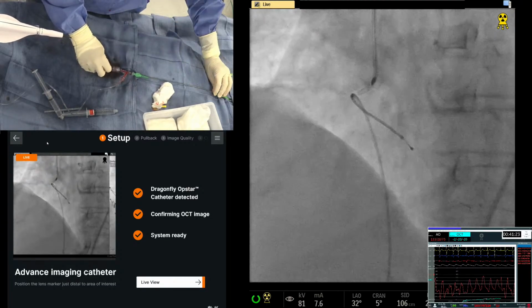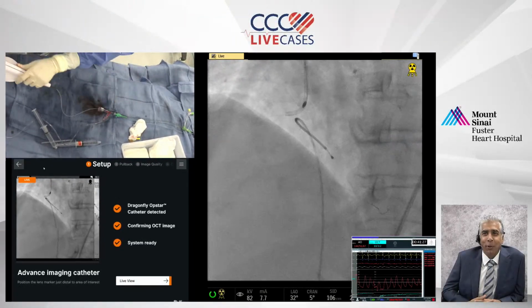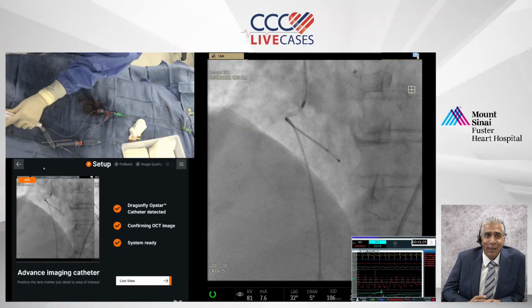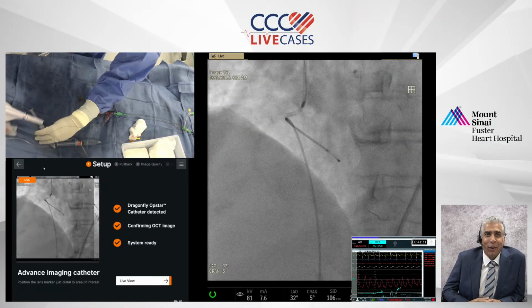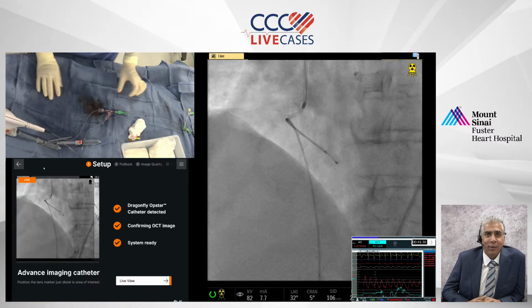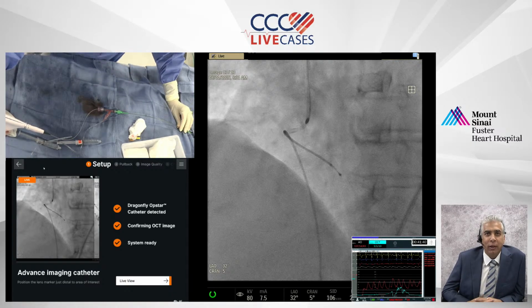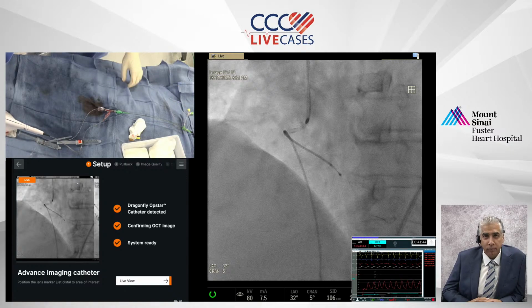I think your OCT eyes tell you it's a 4.0 vessel in all likelihood. So a 175 is less than half the artery size. It's a straight vessel and the Fine Cross crossed. So all reasonable rationale for a 175 burr. We call it OCT eyes.